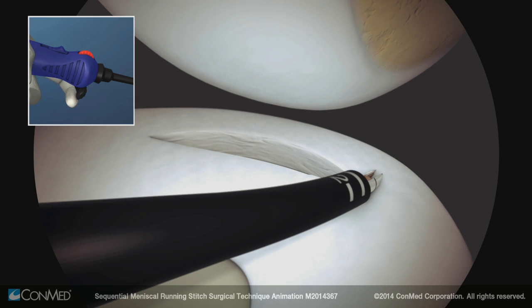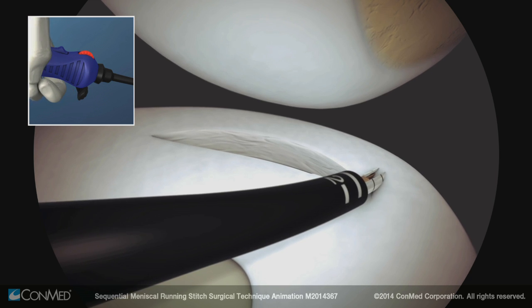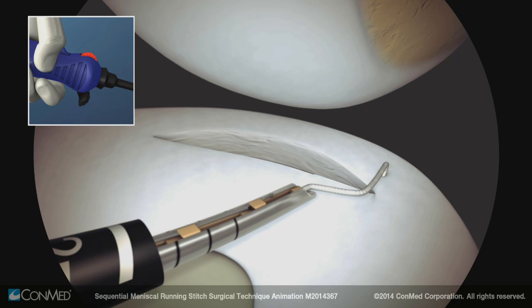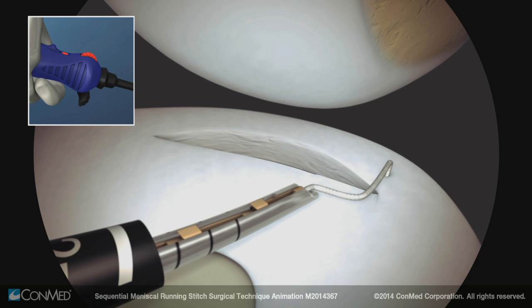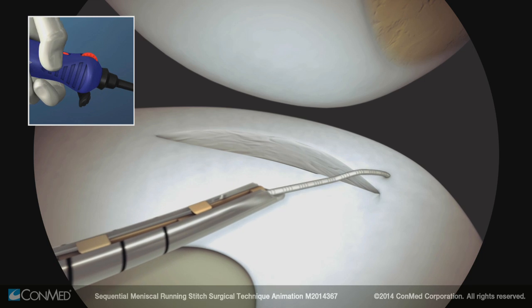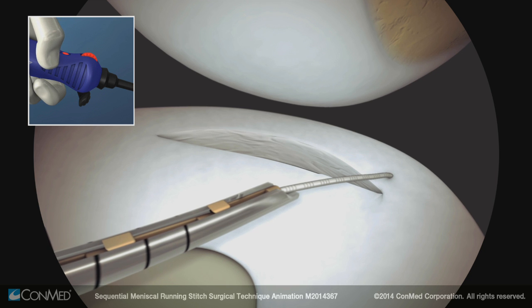To place the first implant, pull back and release the trigger to deploy an implant. Withdraw the needle from the meniscus and move the switch backwards to the ratchet position to tension the suture. The red dot should be exposed. Pull back on the device and reel the thumbwheel to tension the suture and ensure that the implant is set.